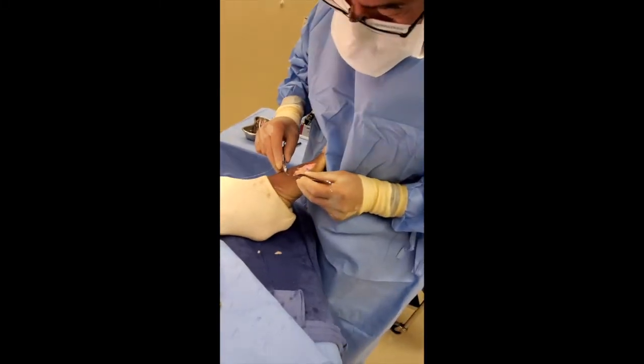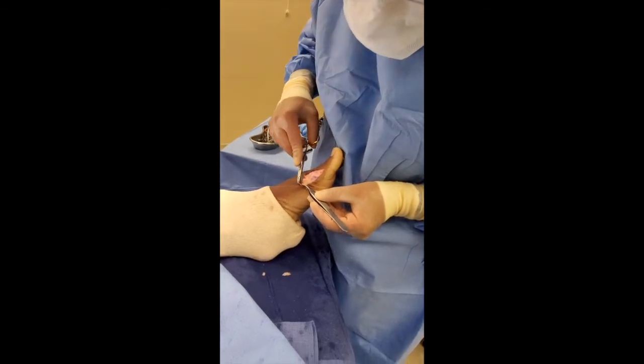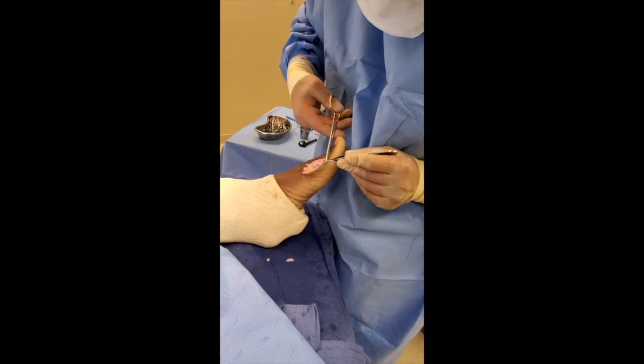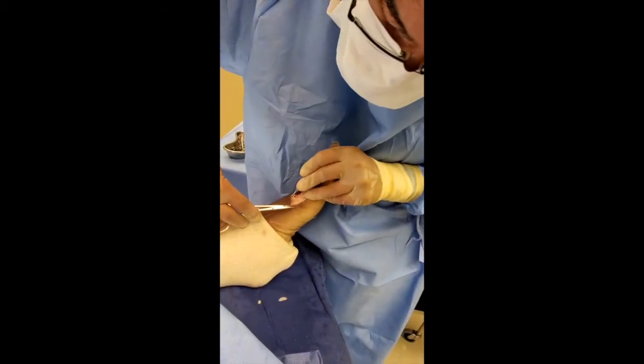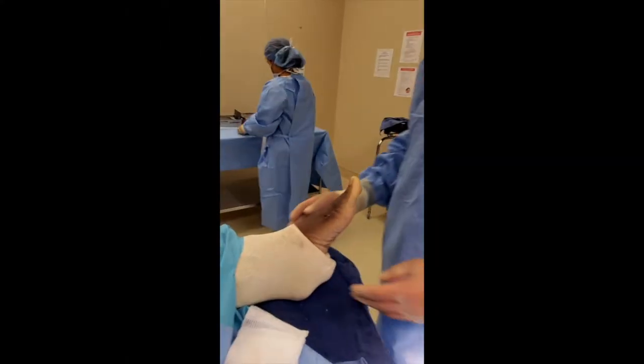We're going to go back and forth through the skin layer, pulling a running subcuticular stitch — that's a cosmetic stitch — so we don't see any of those railroad-tracking marks through the skin. We close down and run all the way through. All right, we're done.